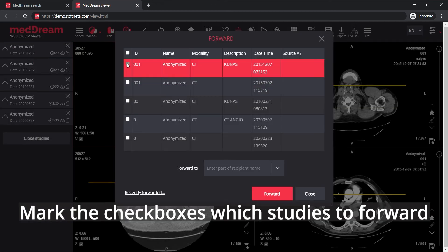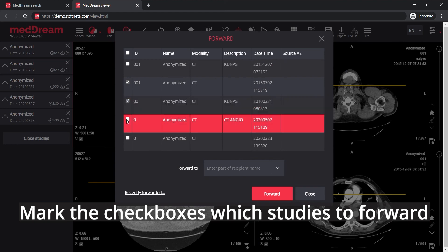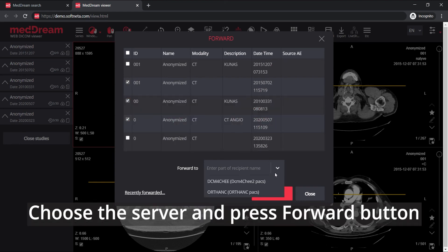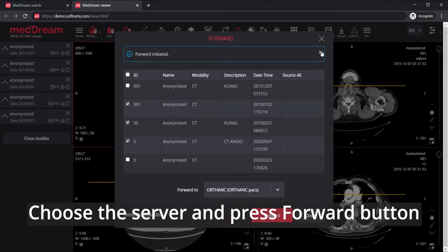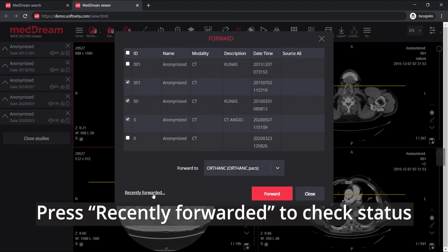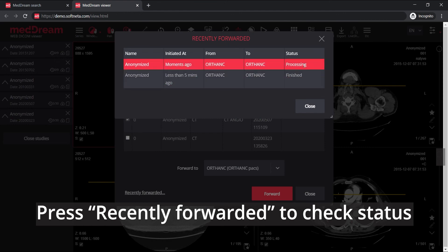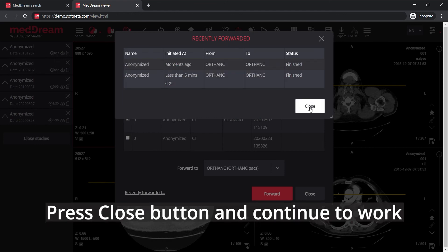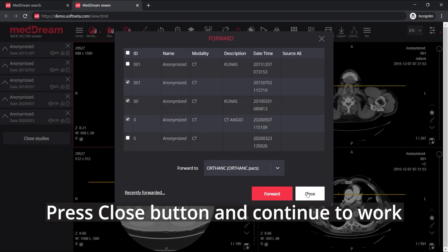Mark the checkboxes to select which studies to forward. Choose the server and press the forward button. Press recently forwarded to check the status and confirm if forwarding is already finished. Press close button and continue to work.